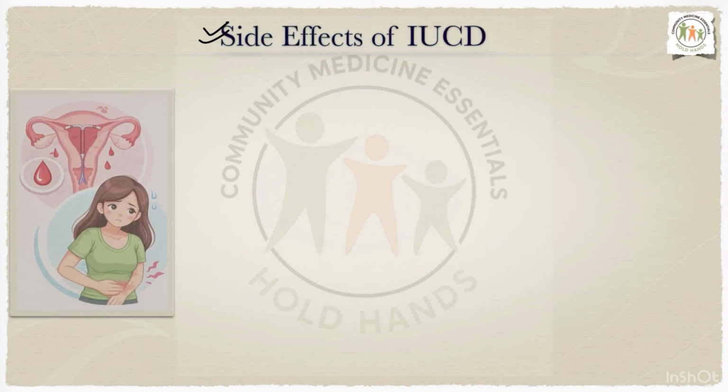Next is, what are the side effects of IUCD? The most common side effect is bleeding. It usually settles in 1 to 2 months.